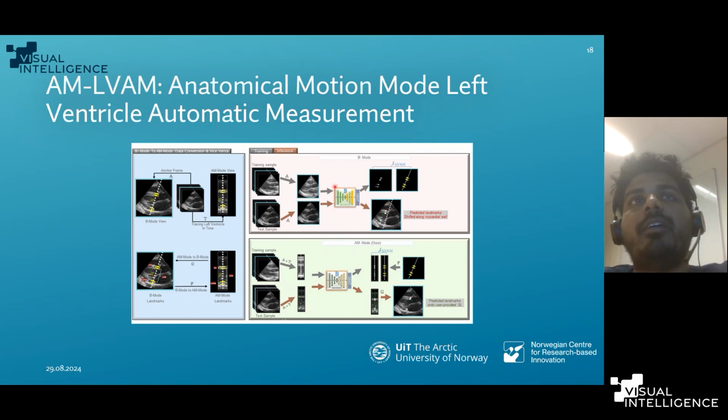So we are proposing this algorithm, which is very easy to compute, and it does not require any fancy computation, just an interpolation function along the derived scan line, and we train an identical landmark detector with the same loss, and other training settings are exactly the same.